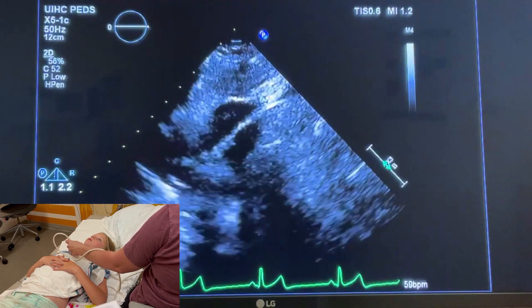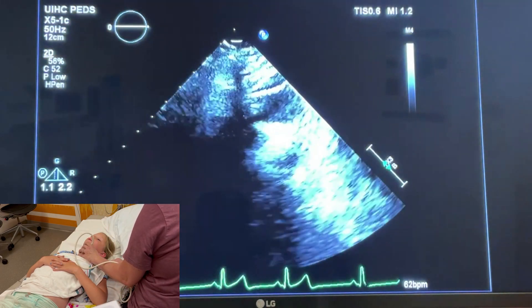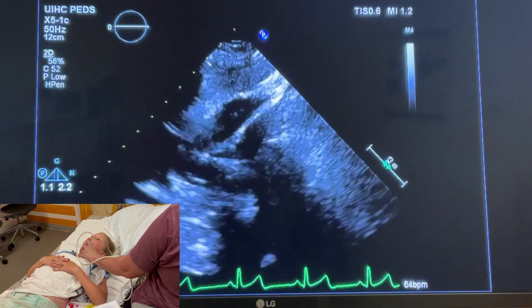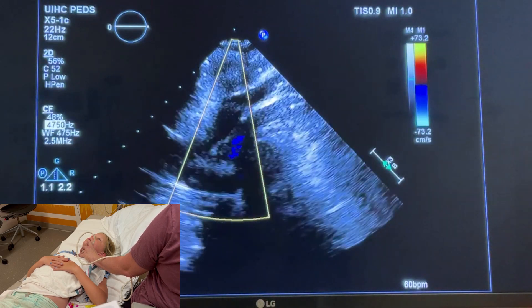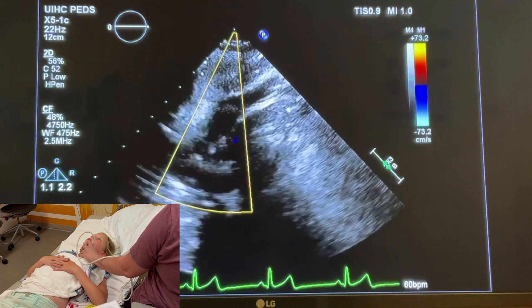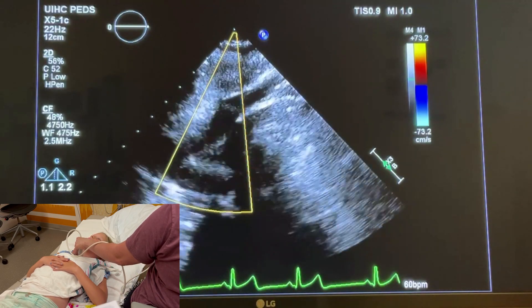You might have to dip in slightly — rock your tail up. Think of it like a flashlight: you're going to look over at the SVC. Here you can see the SVC, and if you aren't sure, you can put on color. You'll see that low-wave color pattern — you know that's venous flow because it's low velocity, low flow.